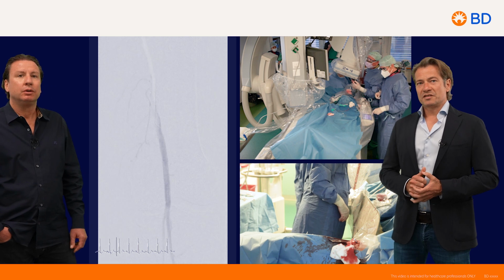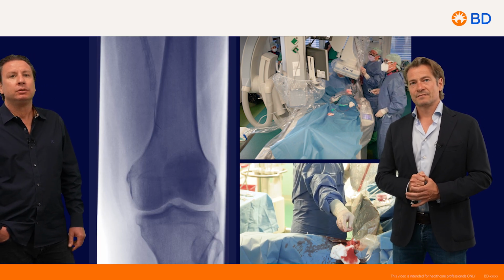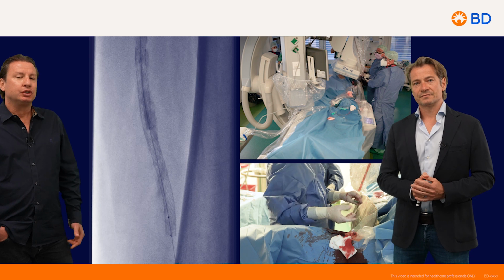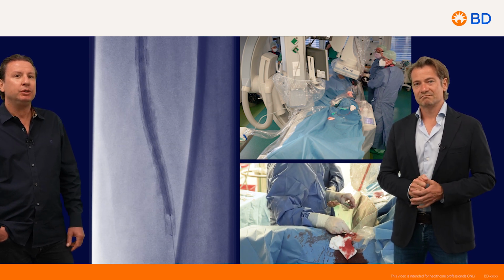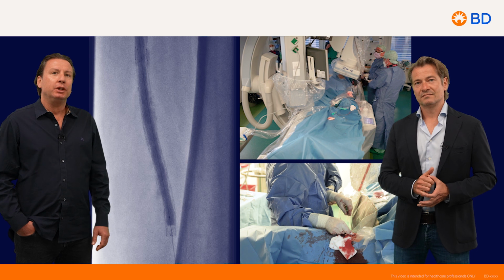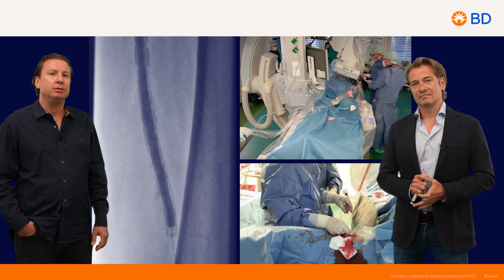There's still no embolization so far. So perhaps you can see here the calcification. It's a severe calcification. So actually the stents, 6 years old, look not too bad. Here we went in with another balloon just to touch up, to give ballooning of the entire stent area with 6 millimeter balloons.